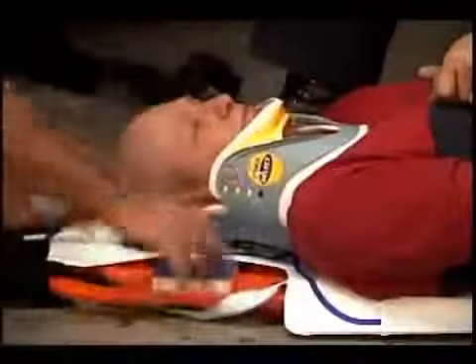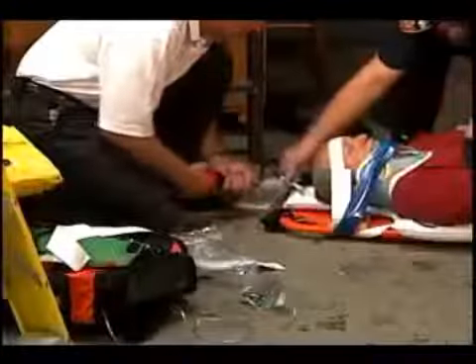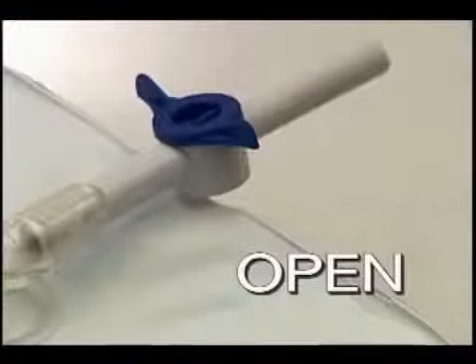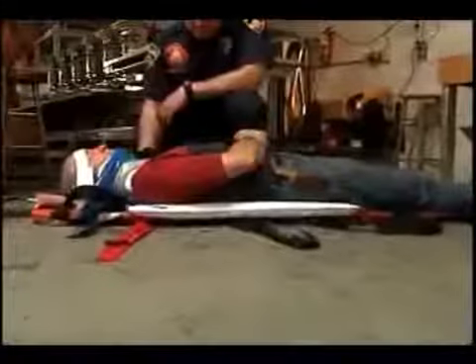Once the patient is properly positioned on the backboard and back raft, ensure the valve is in the open position. Counterintuitive to other gate valves, the design of the back raft inflation valve prevents accidental opening of the valve after inflation. Therefore, a T position of the valve is open, and an inline position of the valve is closed. Next, connect the rapid inflation hand pump tubing onto the back raft valve. If possible, advise the patient they may hear some air being pumped into the mattress by their head and begin to inflate.